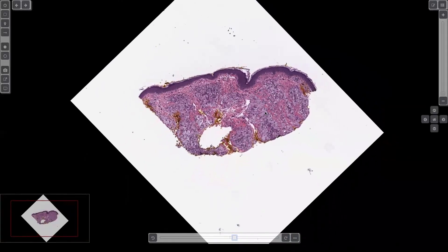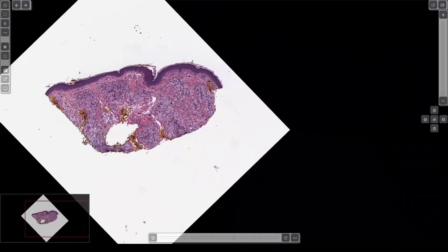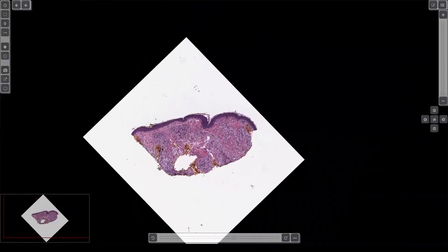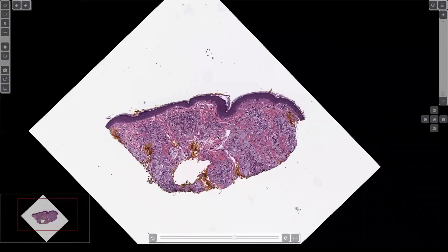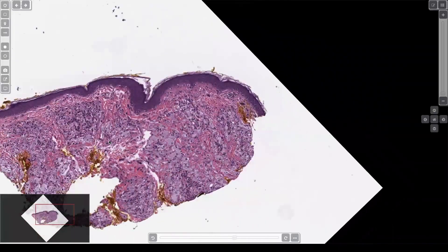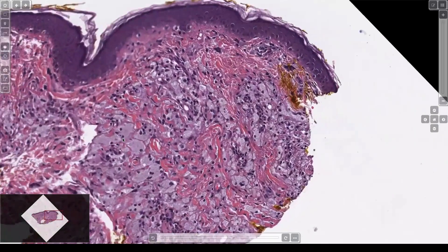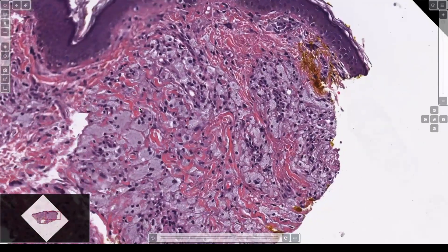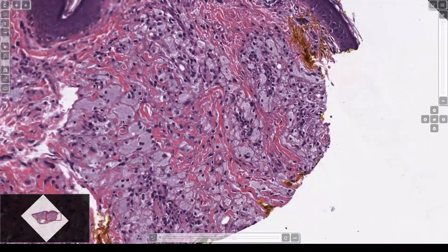Here we've got an infiltrate in the dermis; the epidermis looks normal — ignore the orange, that's just ink, for those of you who are new residents here. And we've got these big frothy looking cells here; they've got round nuclei and a bunch of foamy cytoplasm.